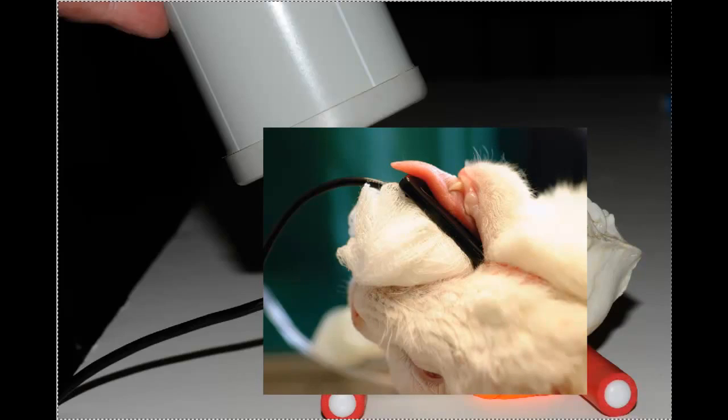Now, I have a photograph of a live cat. This was supplied to me courtesy of Dr. Ira Luskin at the Animal Dental Training Center in Baltimore, Maryland. He's a board-certified veterinary dentist. And this is a live cat. Here we have the trach tube over here, you can see. And notice that because you can't get the sensor under the tongue, we're shooting straight through the tongue. So, this is the same shot as we were just looking at on the skull, except that there is a towel that's been put under the cat's head to prop it up a little bit.